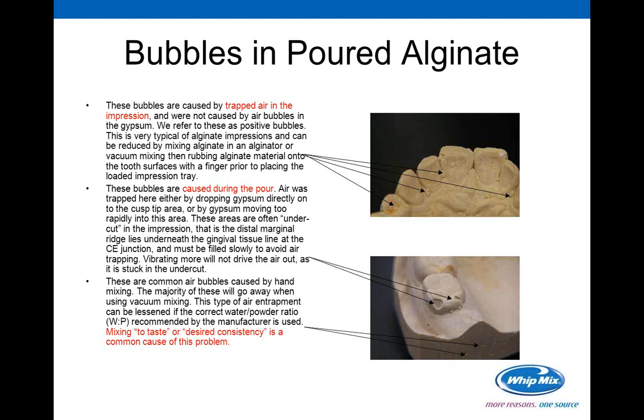And you don't want to turn it up onto mega vibrate and assume that it's getting rid of it. It will get rid of quite a bit, but it will not get rid of all of it. And in fact, you can have other problems, which we've discussed in pouring model webinars prior. So keep it down.